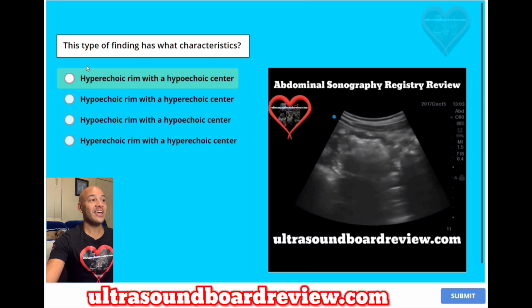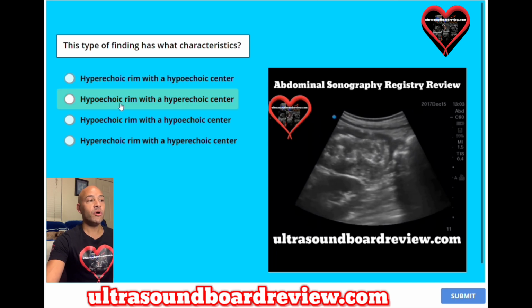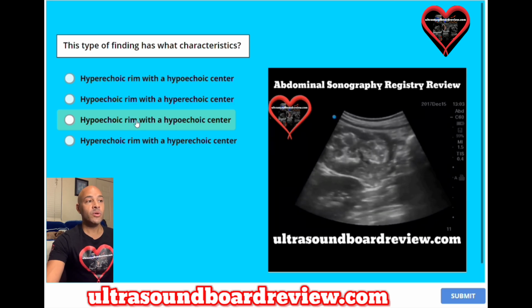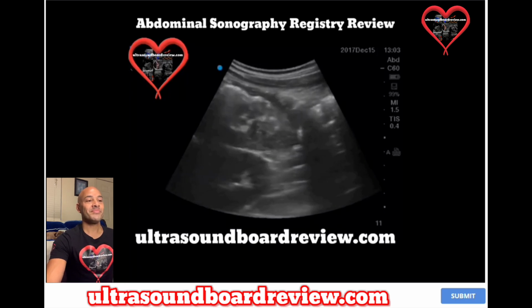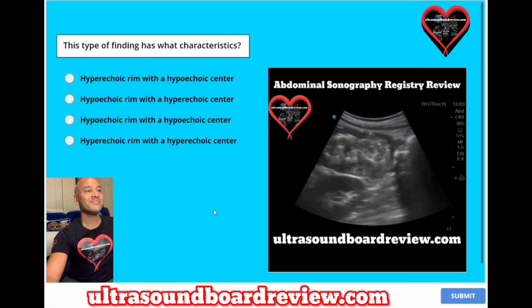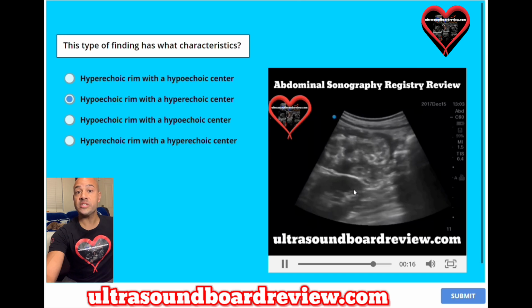Question 126. This type of finding has what characteristics? A. Hyperechoic rim with a hypoechoic center. B. Hypoechoic rim with a hyperechoic center. C. Hypoechoic rim with a hypoechoic center. Or is it D. Hyperechoic rim with a hyperechoic center? The answer is B, hypoechoic rim with a hyperechoic center. This ultrasound represents a patient who has a pseudo kidney.